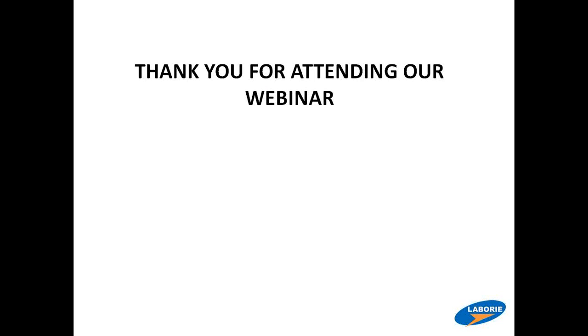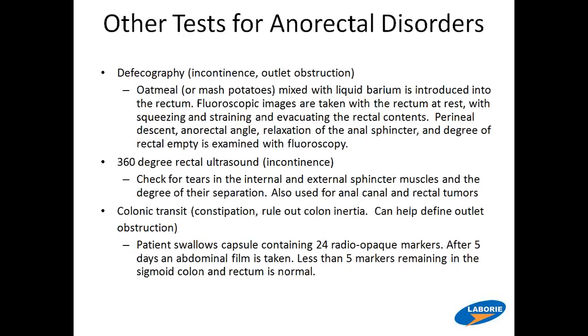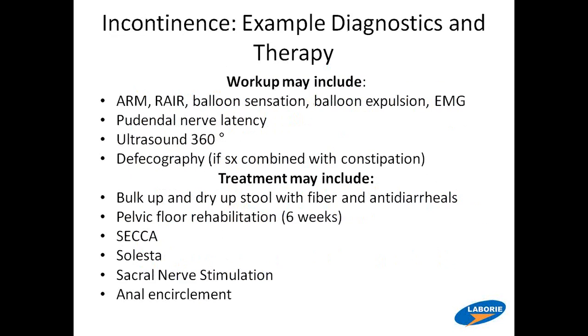Dr. Callie, there was a question that came in earlier when you were talking about that hypertonic study. Yeah, sure. The person that asked the question isn't on anymore. He dropped off a little bit ago, but I'll ask you anyway. Why might you choose to use the high-resolution manometry versus using the catheter? He asked this question around the time that you were going over that hypertonic case. Oh, I see. So maybe he was just thinking about it. I think it's preference. I think the high-resolution manometry as opposed to regular manometry, which is all I have.